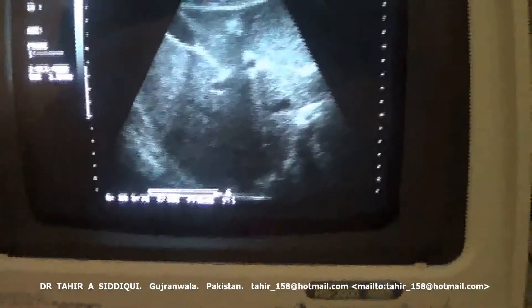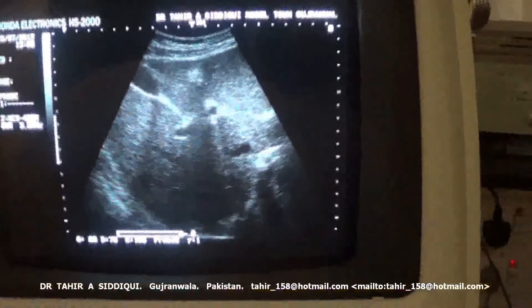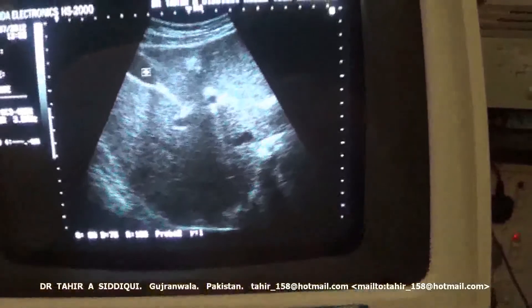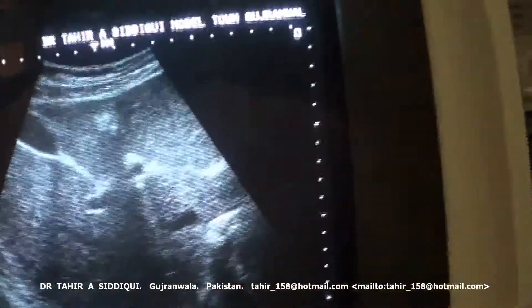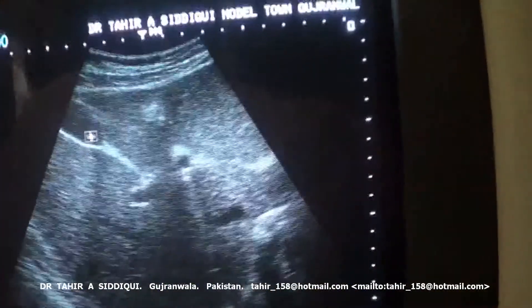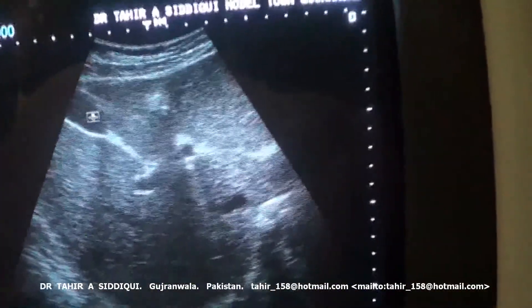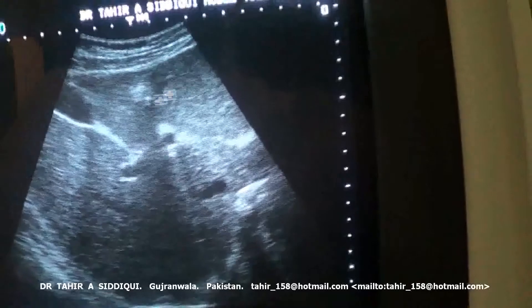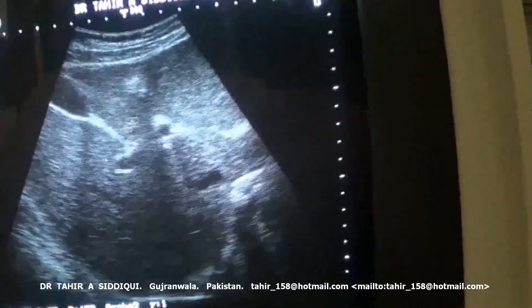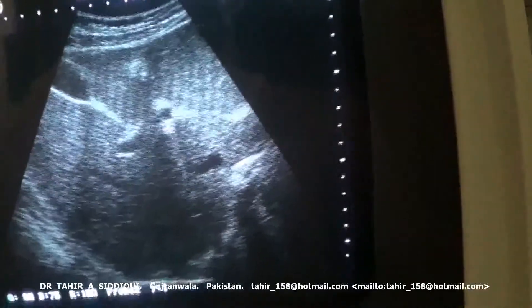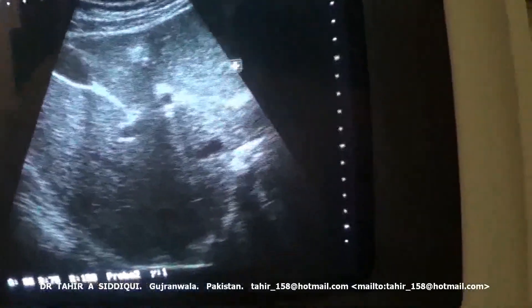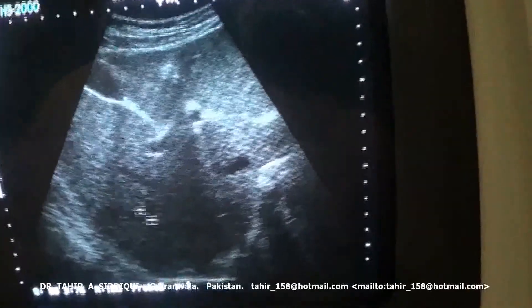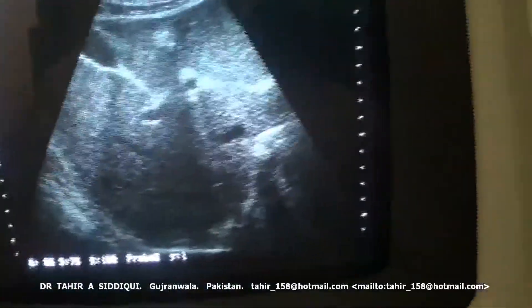In this video segment, we are seeing the gallbladder — this is the gallbladder. This is the transverse section of the left lobe of the liver in this area, and this is the right lobe of the liver.